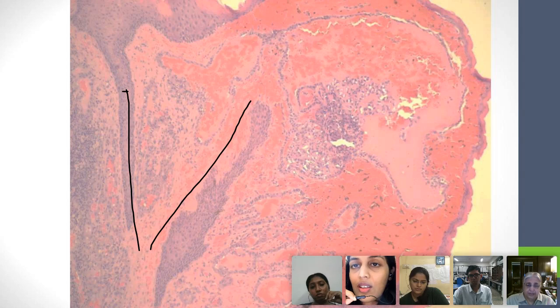So there is one basal layer, there is one layer of spinous process, and then there is... You mean those are the layers, but how many actual layers of cells? At least 6, 8 layers, 10 layers? Ma'am, at least 10 to 15. Oh, 10 to 15. No, it doesn't reach 10 to 15, but it can't be less than, sort of 5. And do you think that there are so many cells below this?